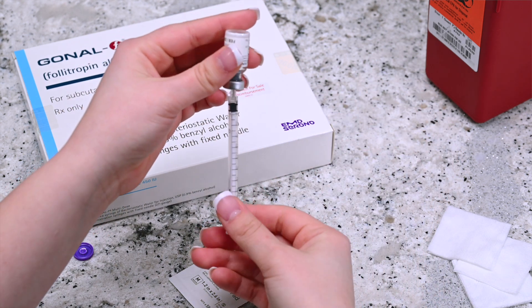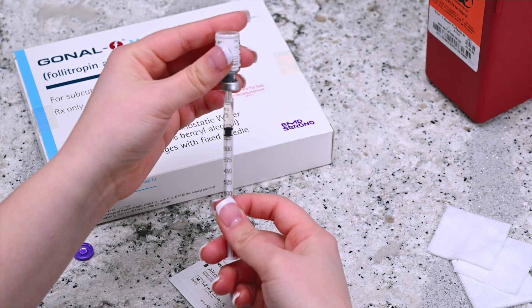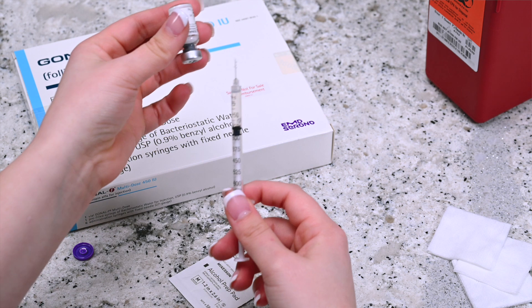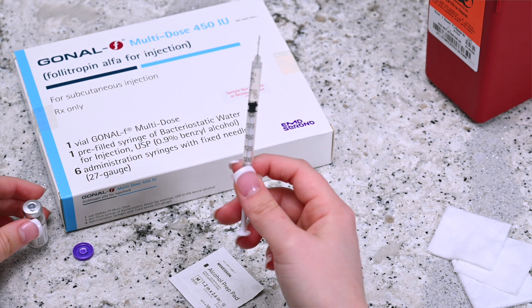Invert the vial that is attached to the needle and syringe, and pull the plunger as you keep the tip of the needle submerged. When the plunger is filled with the correct dosage, remove the needle from the vial holding it upright. Don't let the needle touch anything, including your hands.